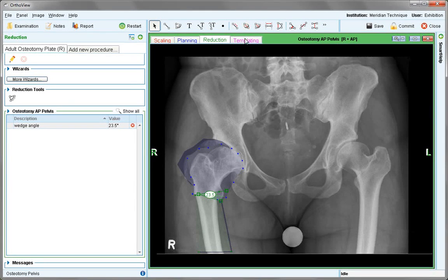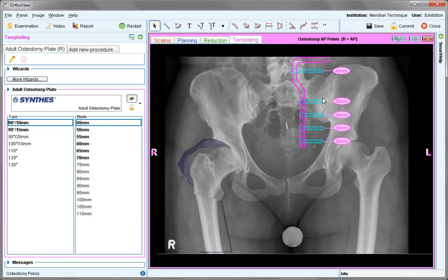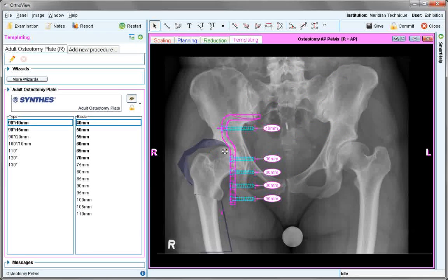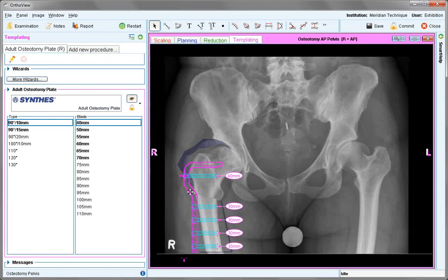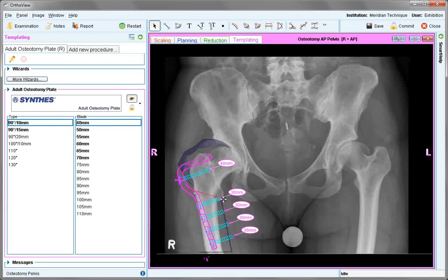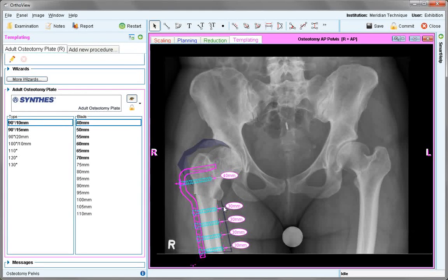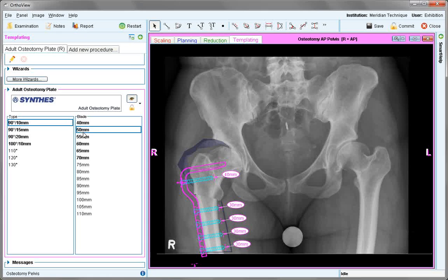This will then appear in the report. When complete, move to the templating stage. Choose from a type and blade as appropriate and move this down to sit against the bone. Right-click on the plate to rotate, or use the small handle and use the arrow keys to position. Look at different size blades as necessary and adjust the screws.